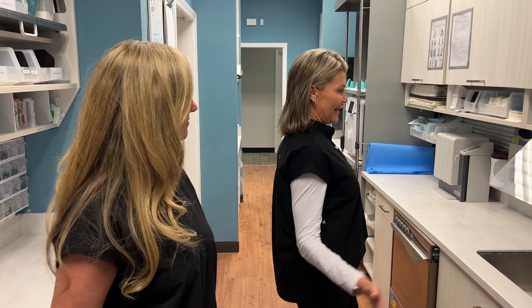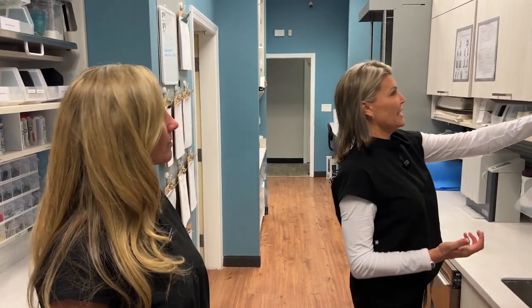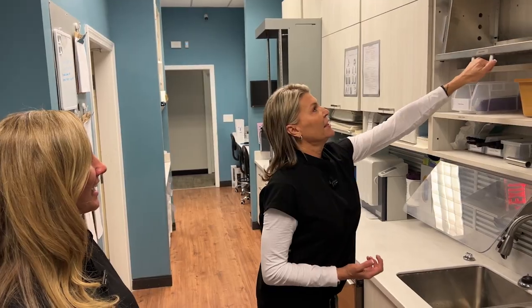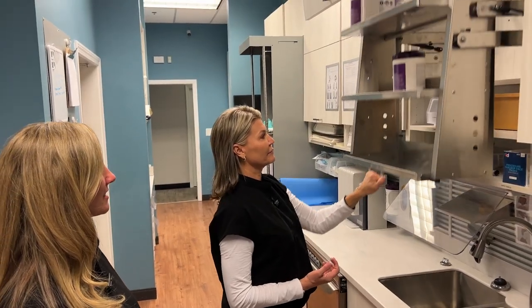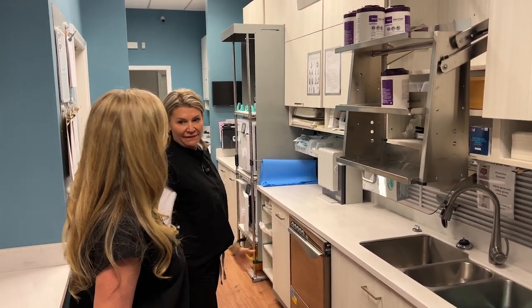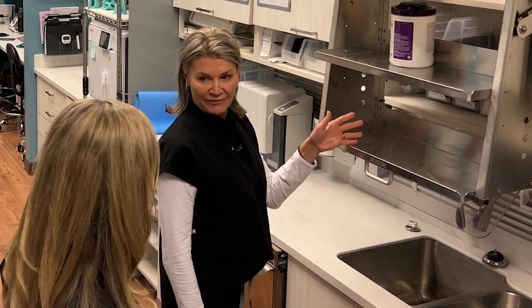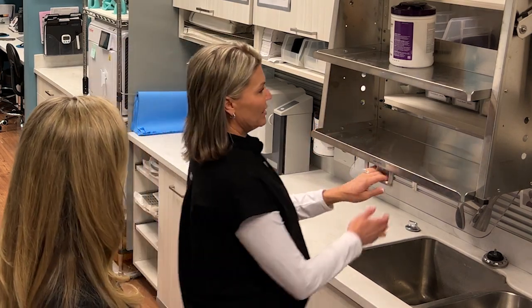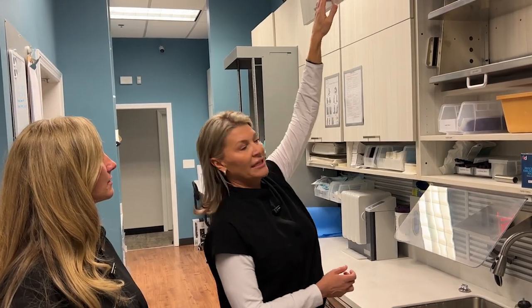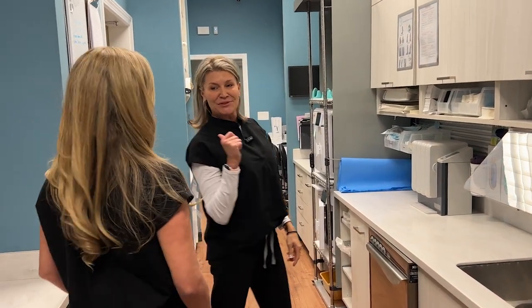So what you'll notice here, Heather, is the triple pull-down cabinets — our signature pull-down cabinets. It's nice to use the space. Our current one, we can't reach the top shelf. You can see how this could be super valuable. The pull-downs are easy to maneuver up and down and easy to access. You can reach that top shelf now. No more step stools.